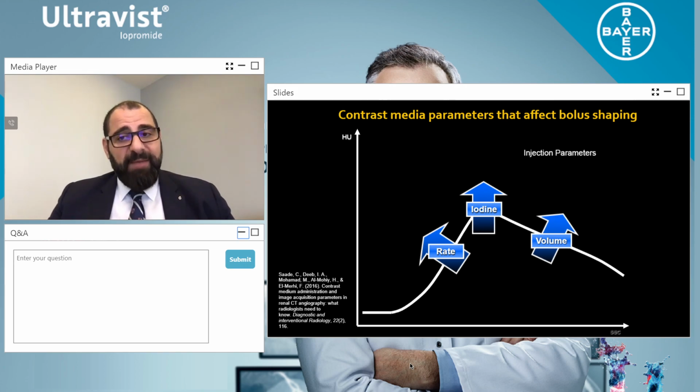So when this happens, if the heart cannot push it out, it then pushes the contrast back down into the inferior vena cava, which goes into the hepatic veins. And you get this artifact. And this artifact is very, very prominent when you're having high flow rates. So whenever you're doing contrast media delivery parameters or injections, having very high flow rates actually works against us.